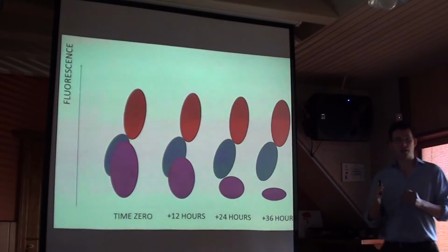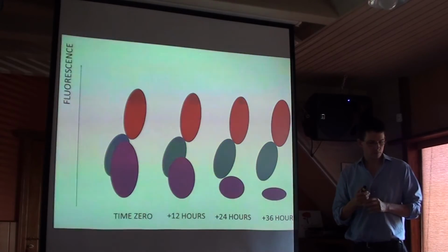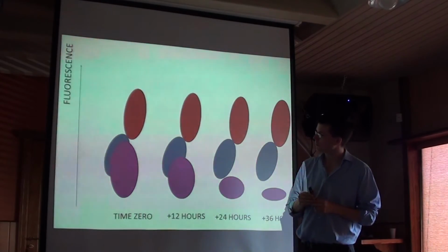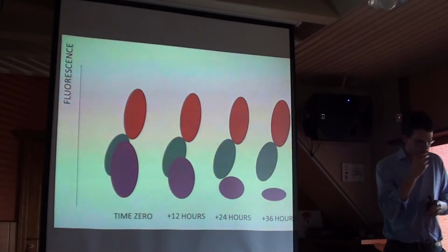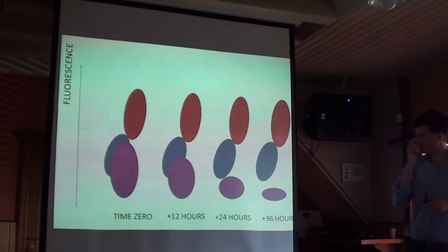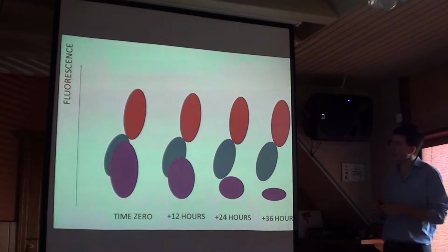So we're now going to look at a time sequence of dot plots to see how it might potentially help our patients. So we have 4 dot plots, each from 12 hours apart. Remember, the life expectancy in health for a neutrophil might be 8 to 10 hours.